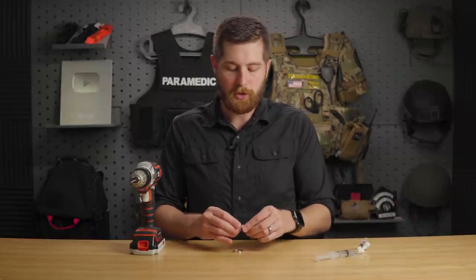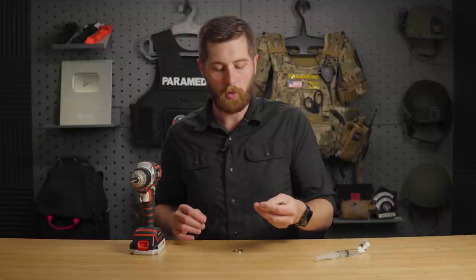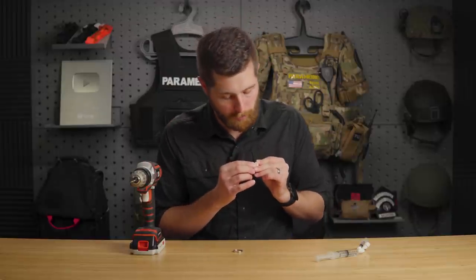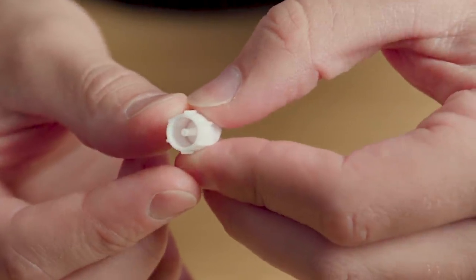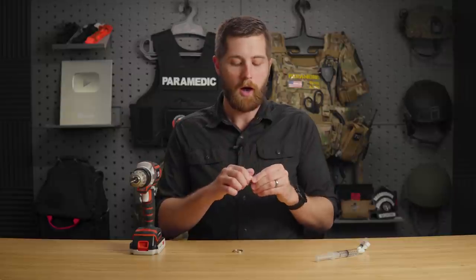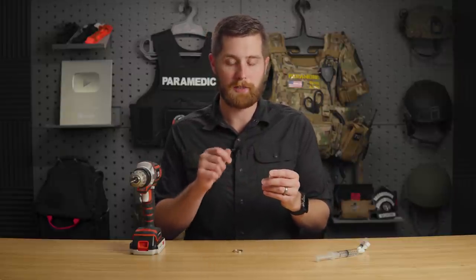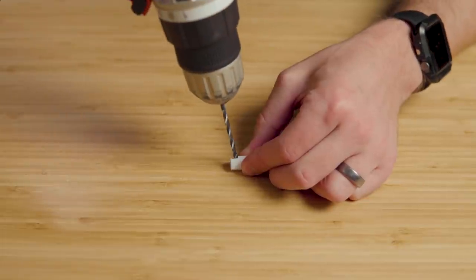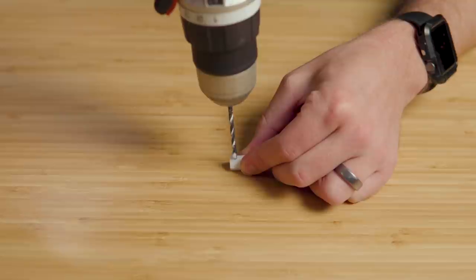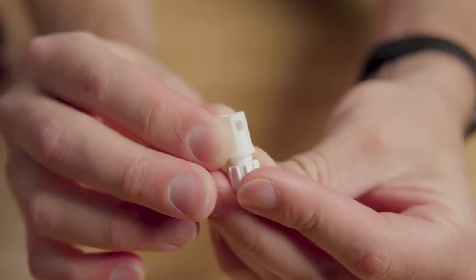The next step, once these two are connected, is to identify a side on the wall of that cap that you can drill through. This cap in particular has a little bit of plastic inside of it — I can drill through that and it's not actually going to damage the seal at all. Other brands will not have that capability, so be careful not to nick the interior plastic. Then take the drill, line it up on the wall of the cap, drill down and withdraw. It's pretty simple.